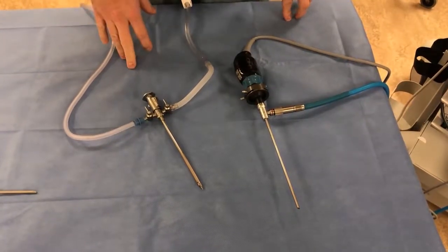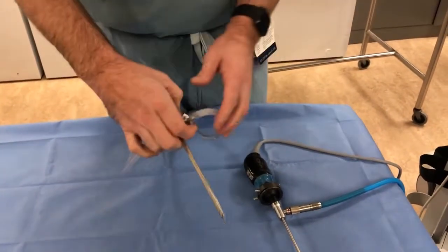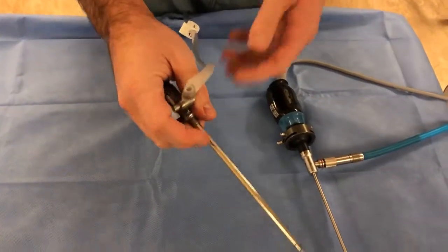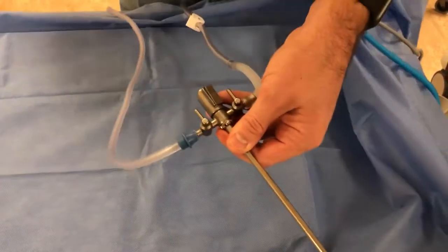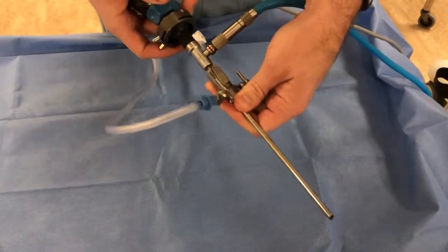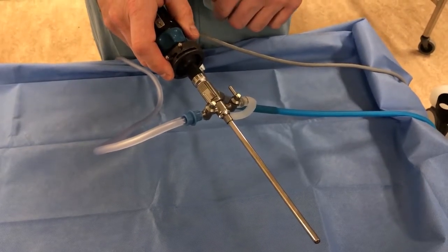At this point we're ready to get into the joint. With the flow on, you hold the trocar in the arthroscopic sheath and put it into the joint. Then you uncouple the trocar, bring your arthroscope, and couple that back together so it snaps in nicely. This usually only goes in with a certain orientation toward the light source, so you just memorize that for whichever system you have. Now that the arthroscope is in the joint, we're ready to go.